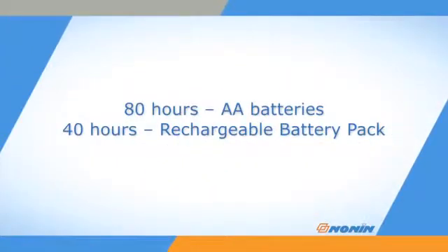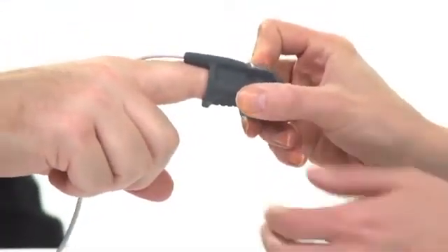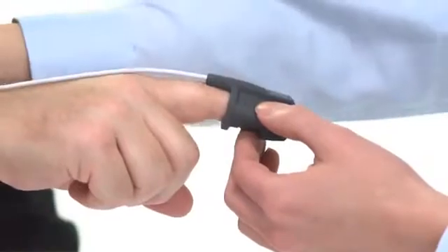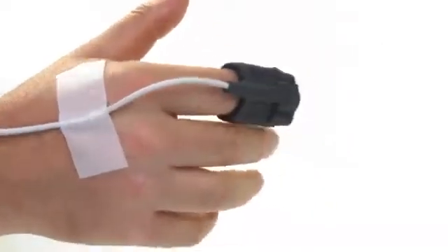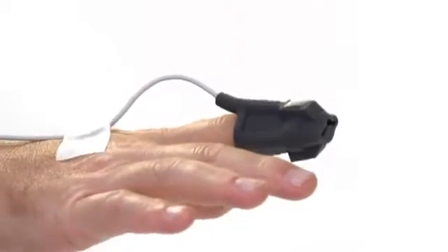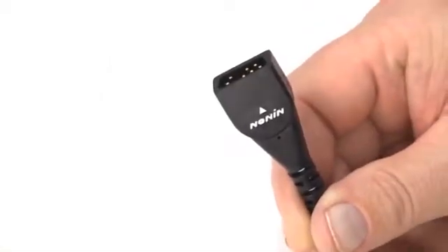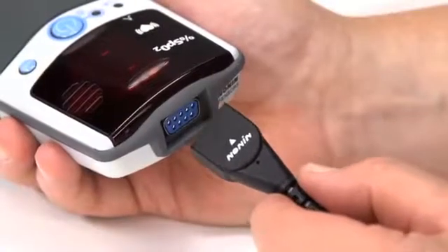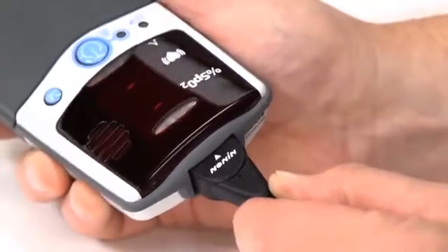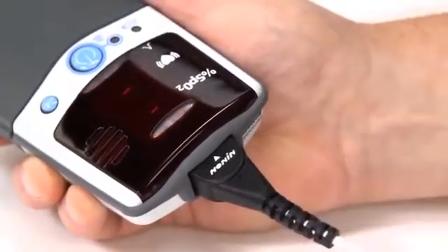The PalmSat oximeter will provide about 80 hours of continuous use with four fresh batteries or 40 hours of continuous use with the rechargeable battery pack. Prepare the sensor and place it on the patient prior to connecting it to the oximeter. Proper sensor placement is critical for accurate readings. Follow the instructions for each sensor type to ensure secure, aligned positioning on the finger or skin surface. Connect the sensor to the pulse oximeter by inserting the plug with the Nonin logo and arrow pointing to the top of the unit as shown here. The connector should firmly seat in the connector port on the oximeter.